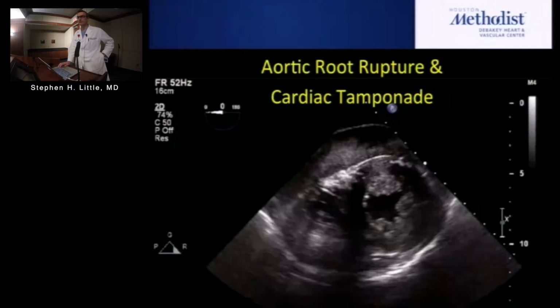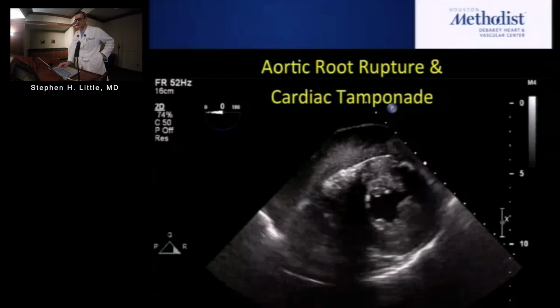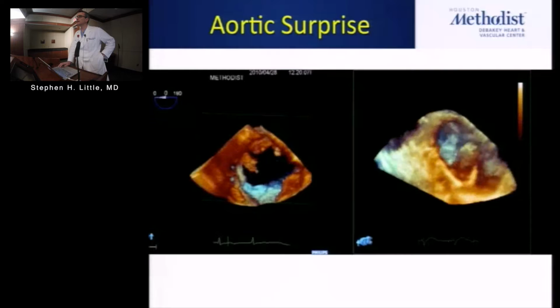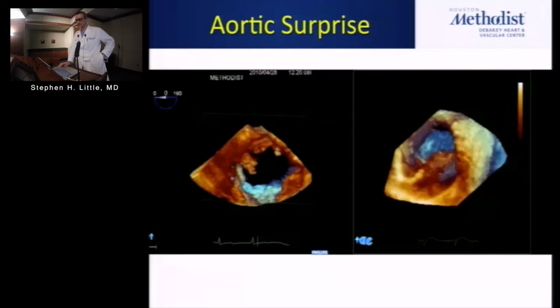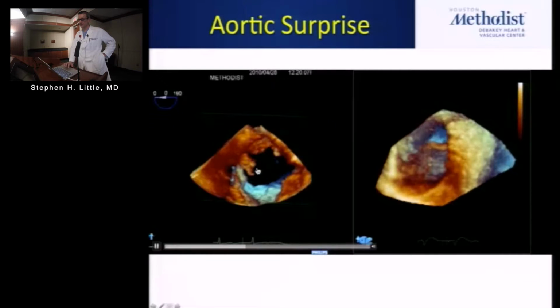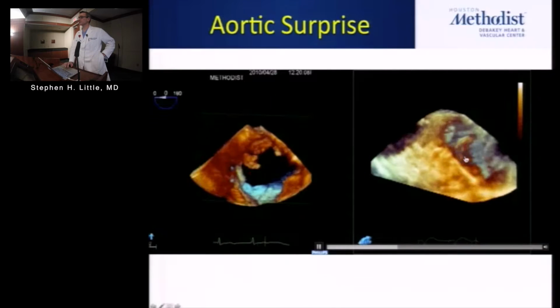Aortic rupture and tamponade and a quick intervention to save that one. Ugly things in the aorta, you can see with 2D. They're certainly well appreciated with 3D. This enormous wiggler, and this post-procedural dissection.